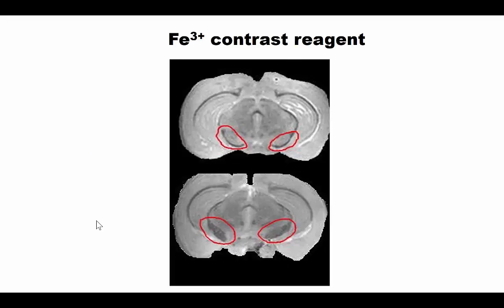Among MRI imaging probes, iron magnetic nanoparticles were found to accelerate the T2 process. If you add a T2 accelerating probe, what do you expect? Brighter or darker image? Remember, for T2 imaging, faster relaxation gives you a darker image.